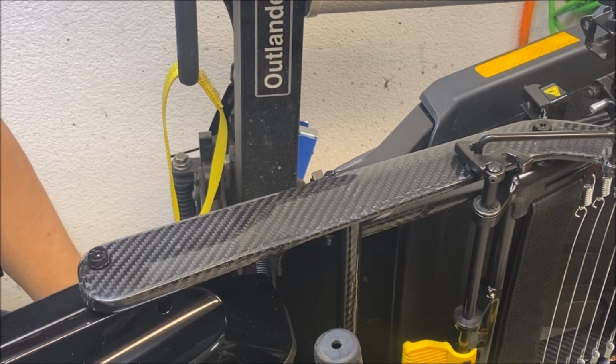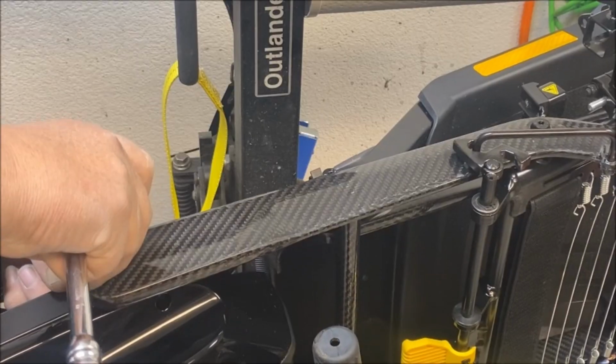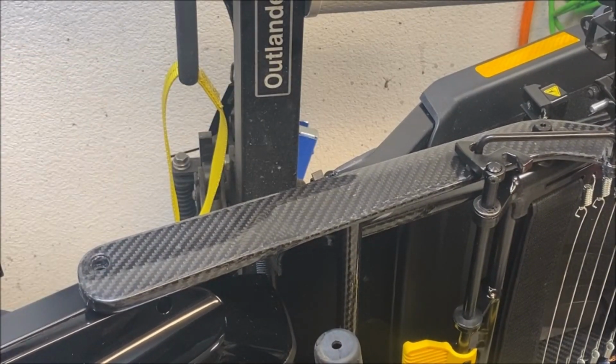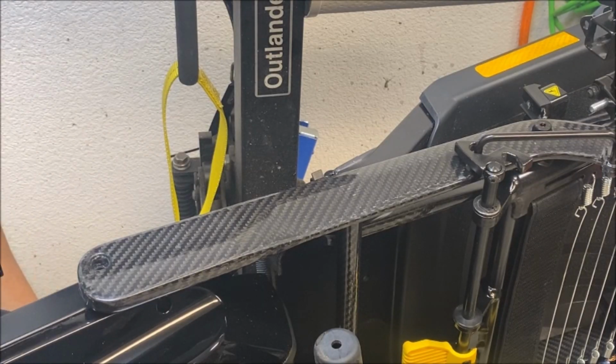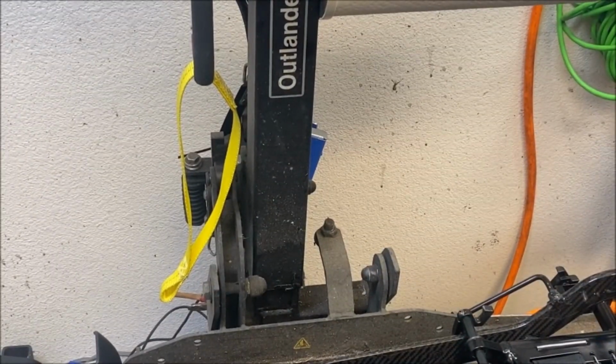And then the actual bolt should slide out. I'll put these back together in the order they came off. I don't know what I'm doing. I can actually flip it back on. A little bit easier.